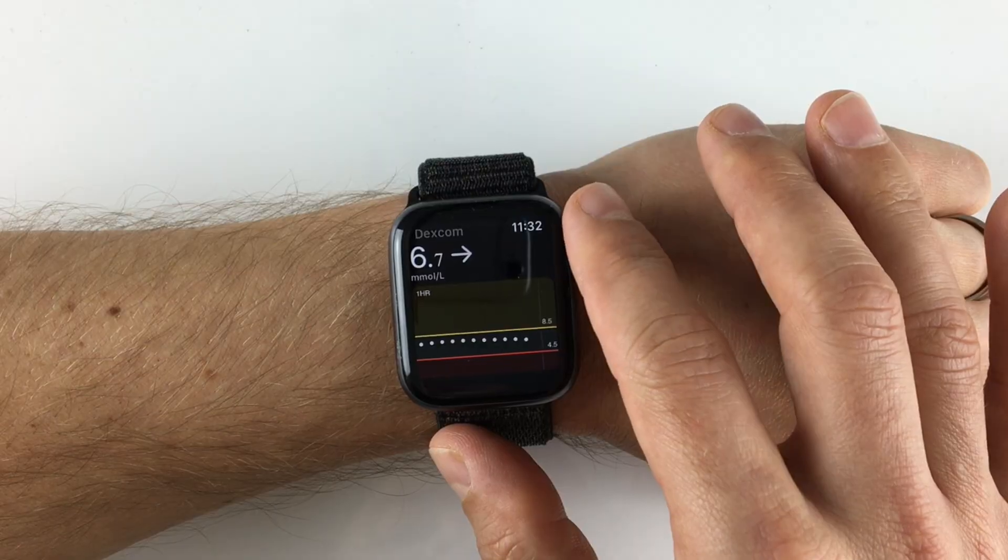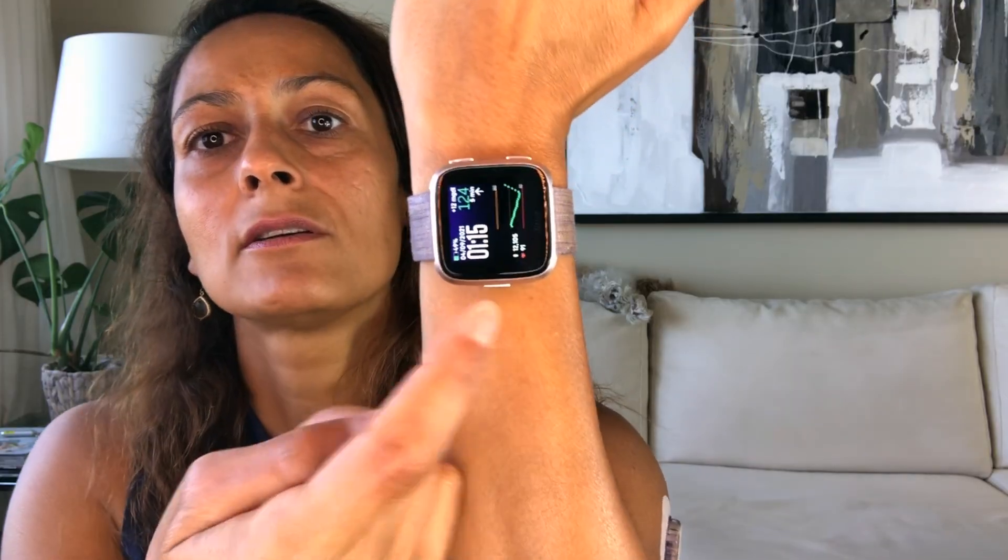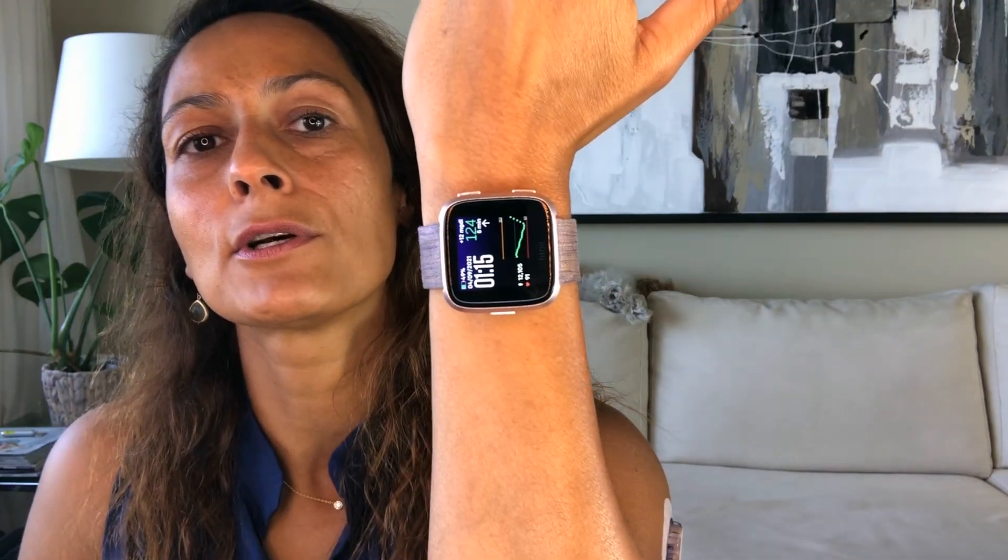That is so cool — I'm going to set this up right after we film this video. If you have an Apple Watch you can also see your reading on that. I don't have one, but I do have a Fitbit Versa. I downloaded a clock face called Glance and that allows me to see my glucose readings directly on my watch. It's not an official Dexcom app but it works.